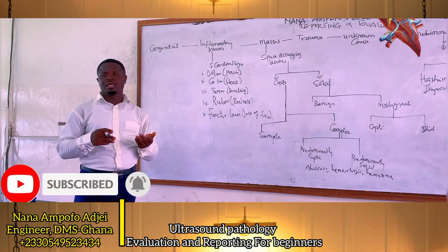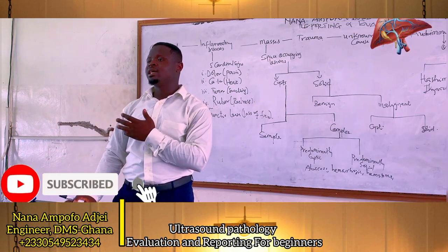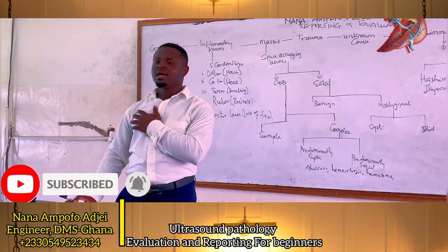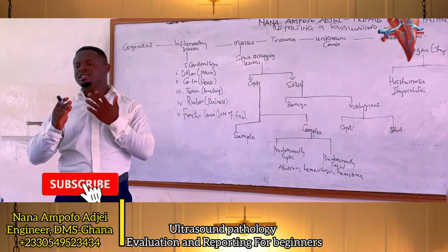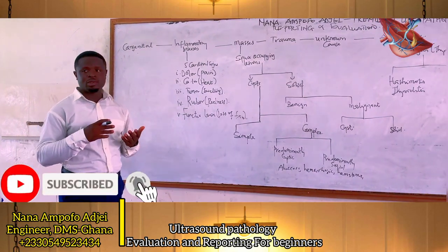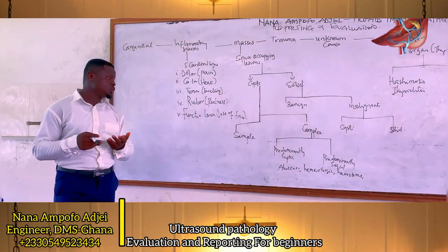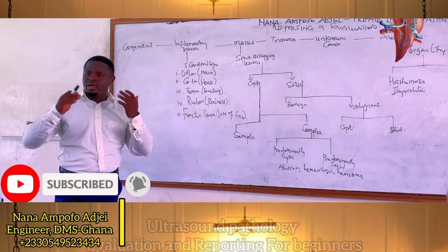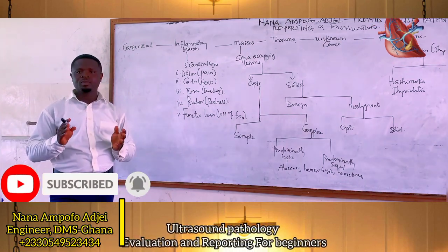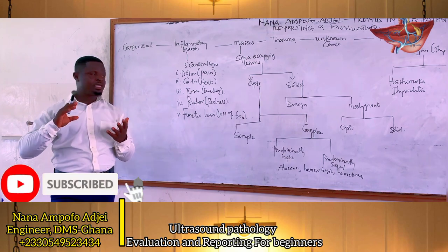So when it comes to the breast, the patient comes to you with all these signs, and you see that there is redness on the part of the breast. Okay, so you scan them and you realize that there are certain changes within the fibroglandular tissues. It is telling you that this is an inflammatory process that is going on. Now you scan and you realize the pancreas is also enlarged. Acute phase, swollen, tissue buildup of fluid, the size increases.